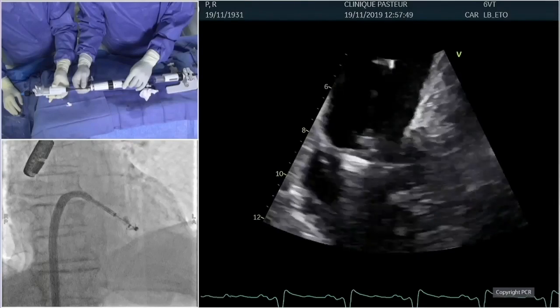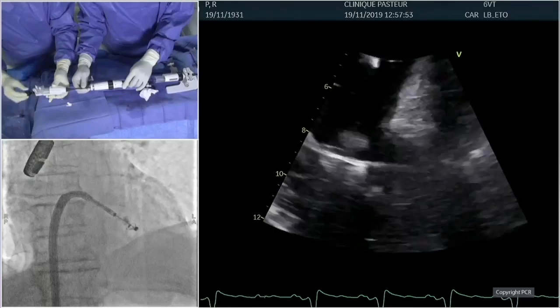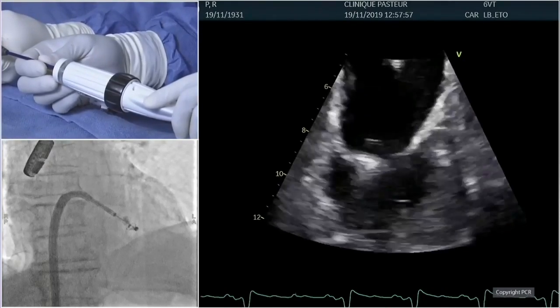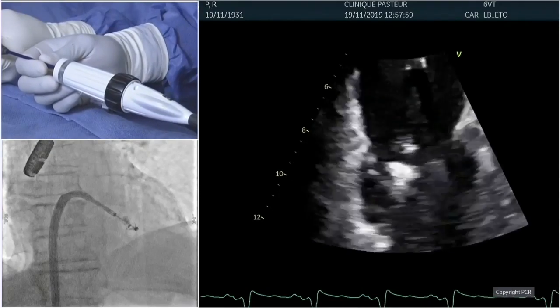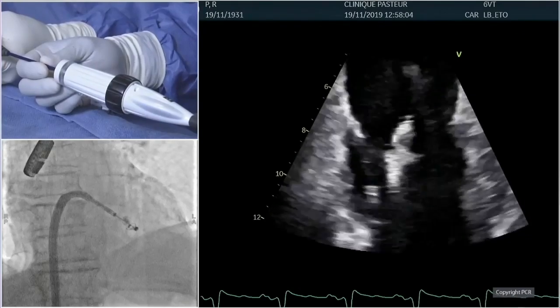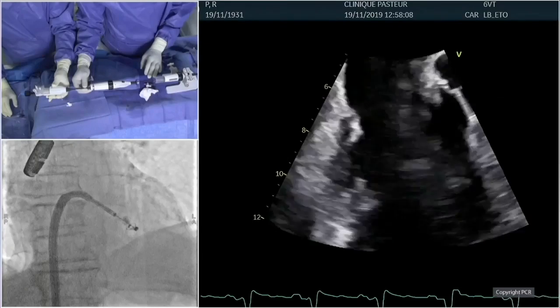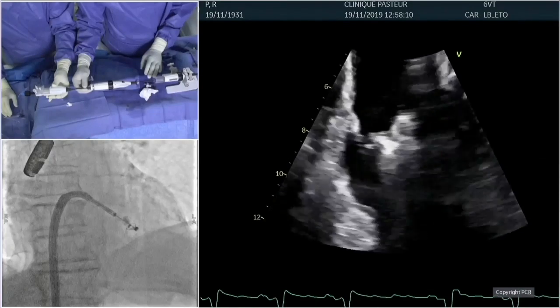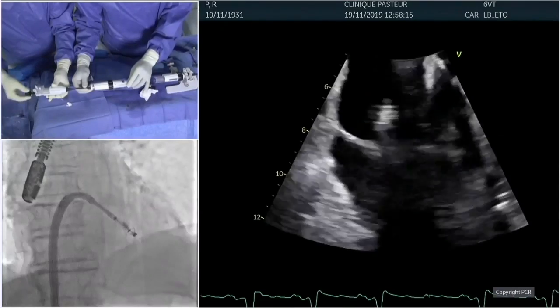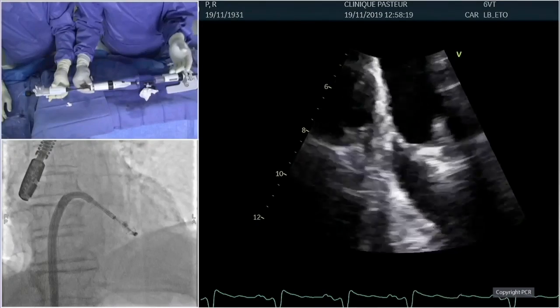And as Becky said, we have a little bit of shadowing because we don't really see everything nicely, but we're going to try to optimize that. Maybe push in a little bit and then mechanically rotate forward another 20 degrees. It's important, before trying to grasp the leaflets, to ensure that we have as nice imaging as possible. So that's crucial because we have to make sure it's improving.